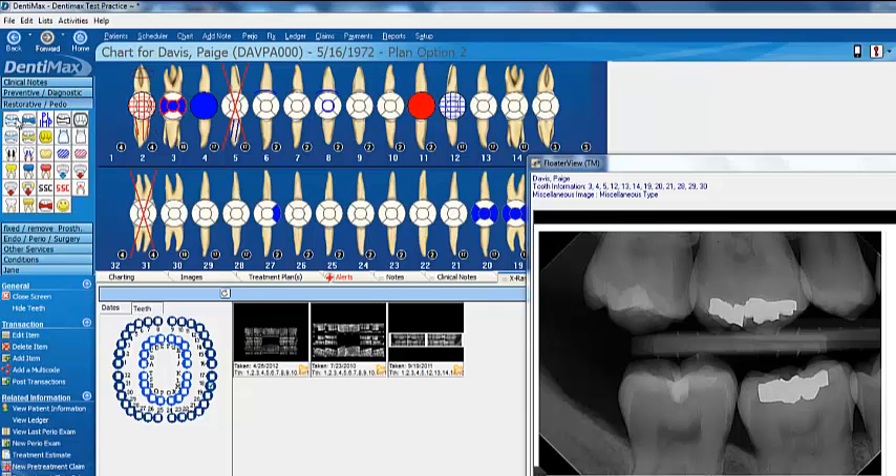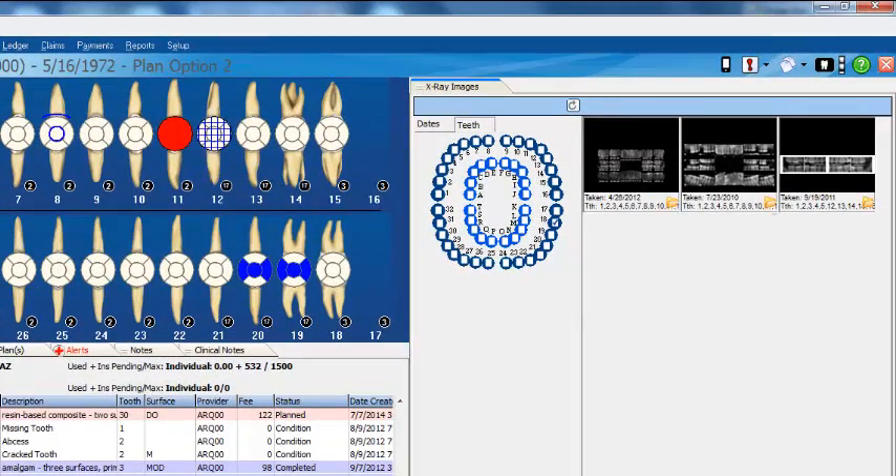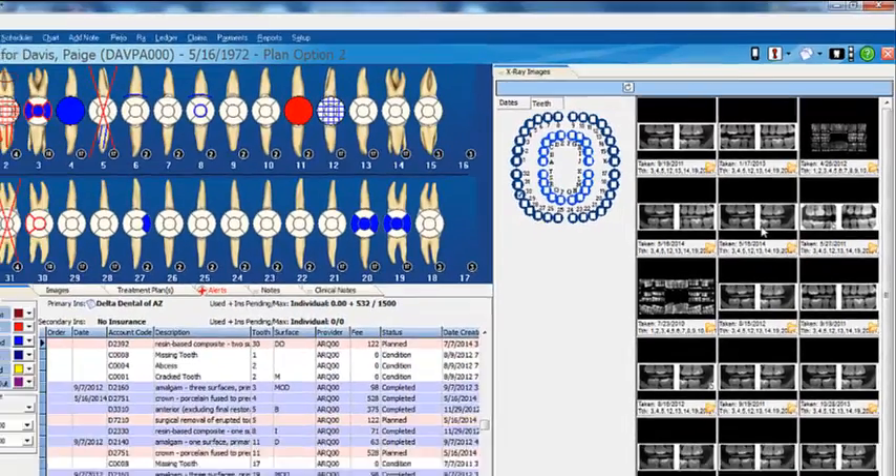Here I am looking at an x-ray. We can go ahead and click on our composite button and do some treatment planning while at the same time viewing our x-ray. Computer monitors are getting bigger and bigger, so if you have extra space to the right, you can simply drag your x-rays over there. You can view all of your x-rays on the right-hand side using the extra space on your large monitor.